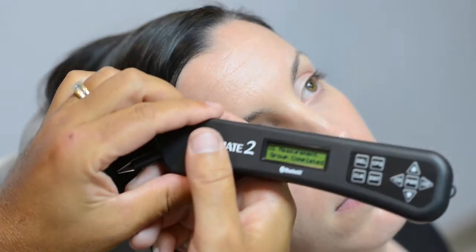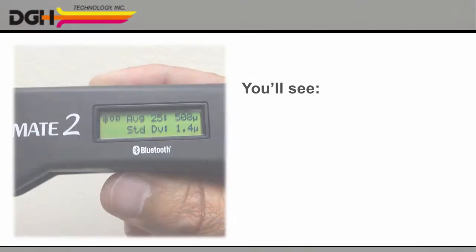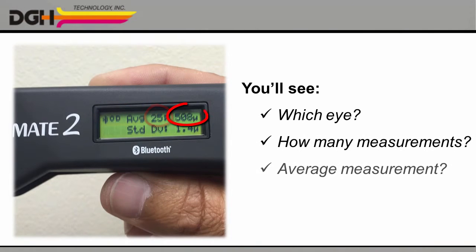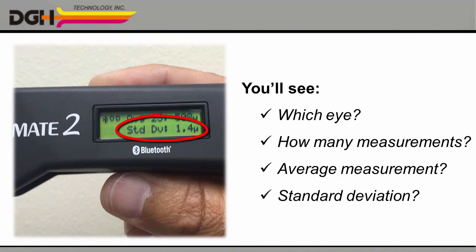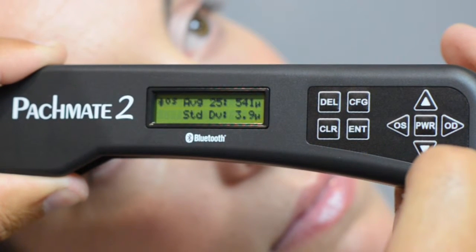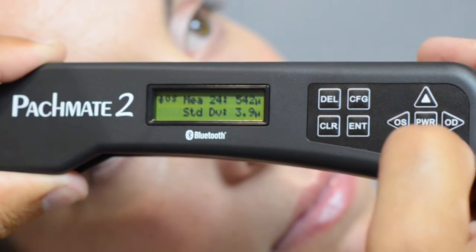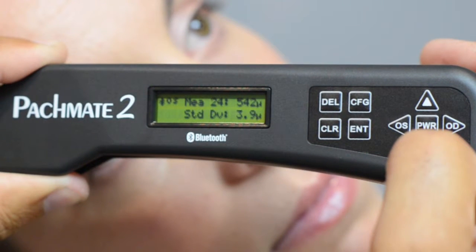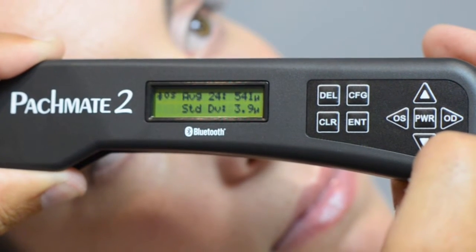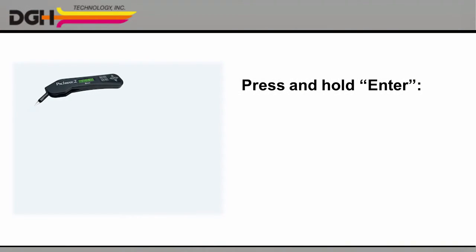Once you've completed your measurements for both eyes, take a closer look at the screen. You'll see which eye you're looking at, how many measurements you performed, your average measurement, and the standard deviation. You can use the left and right arrows to see the measurements for the patient's other eye. Use the up and down arrows to scroll through the individual measurements. Press the DELETE button to erase a measurement and automatically recalculate the average for that eye.